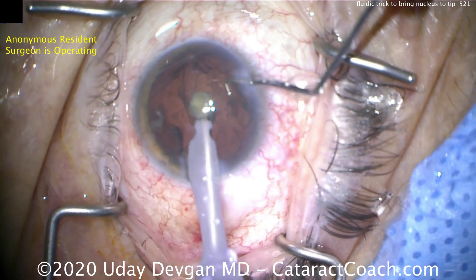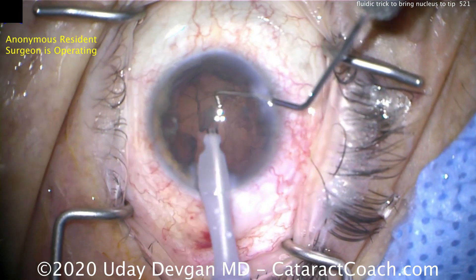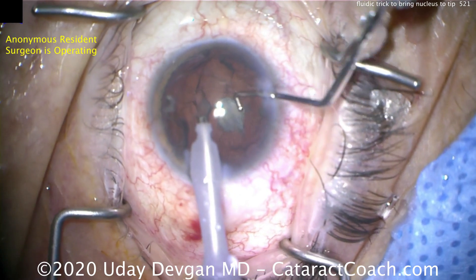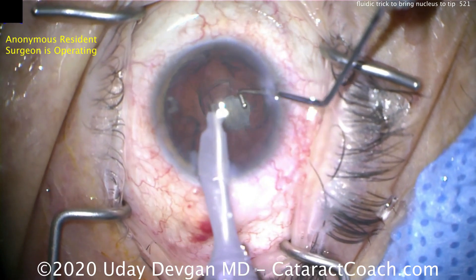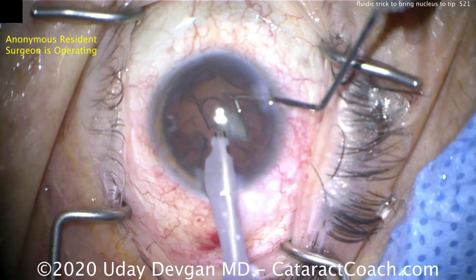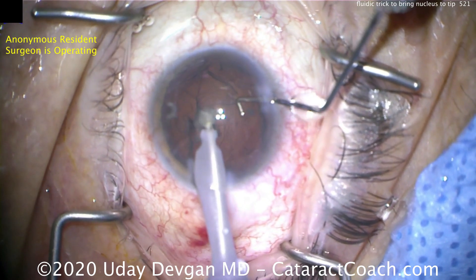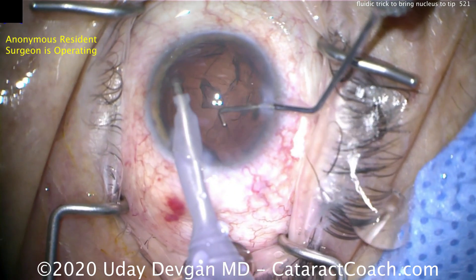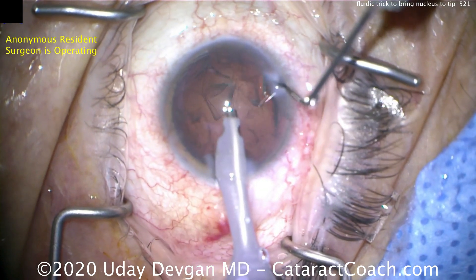I'll push it off again — twist the phaco probe and apply vacuum and it'll come right there, to the tip. Even one more time: twist the phaco probe between your fingertips, a little bit of twist and vacuum being applied, and there you go — the piece comes right to the tip. You don't have to go into the bag, which is higher risk, to chase the piece. Let the pieces come to you.